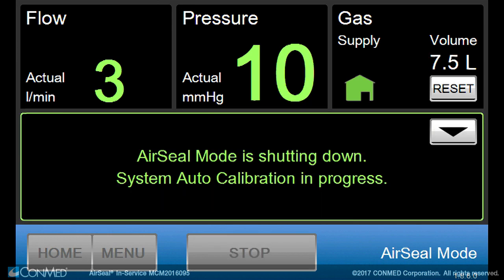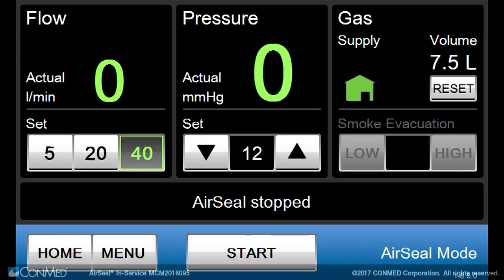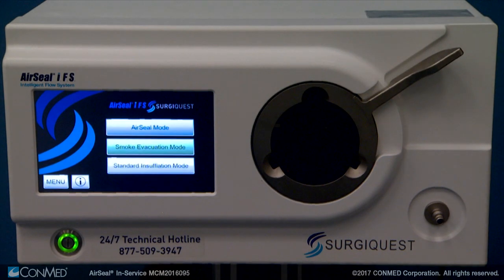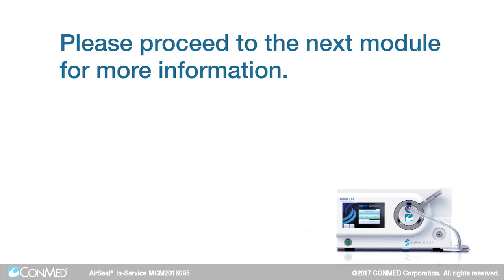At the end of the procedure, press stop. Air seal mode needs to complete a calibration prior to shutdown. Follow the screen prompts and wait for final calibration to complete prior to disconnecting the filtered tube set from the IFS unit and powering off the IFS unit. Please proceed to the next module for more information.